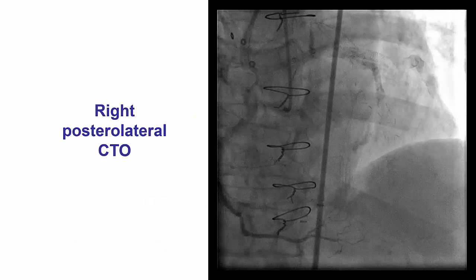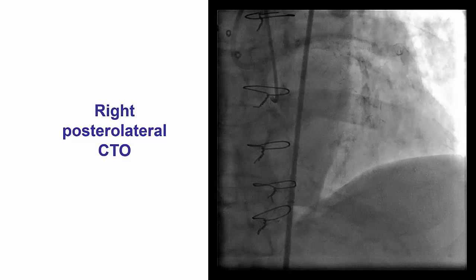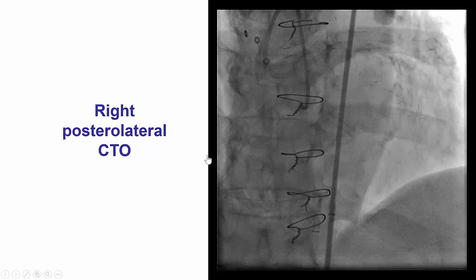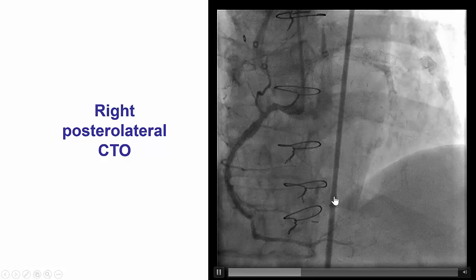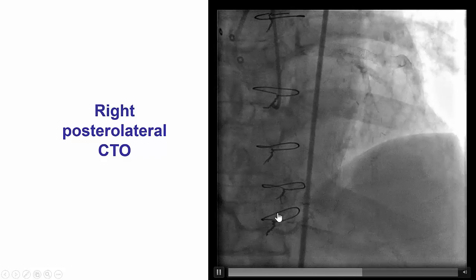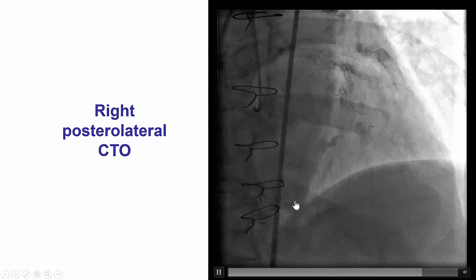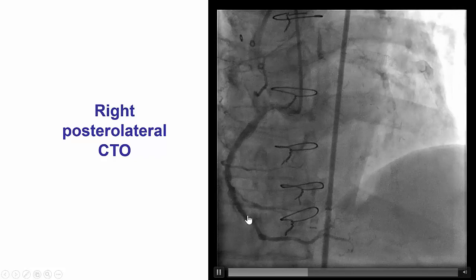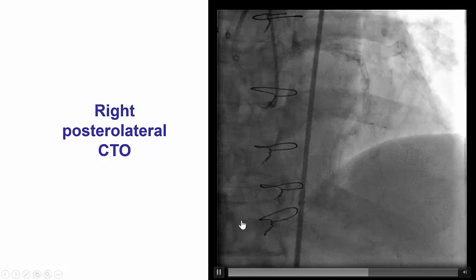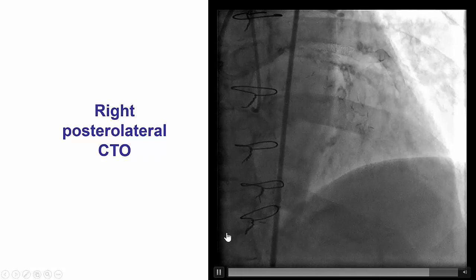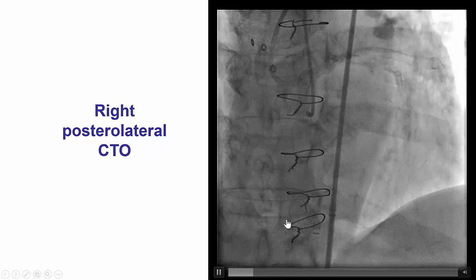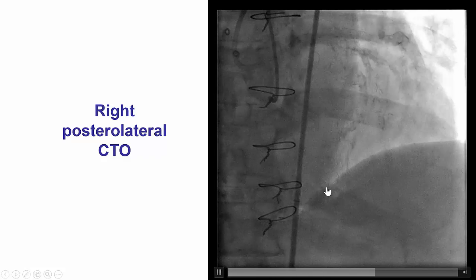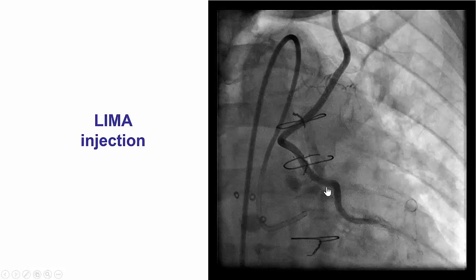The patient presented with refractory angina and had undergone an attempt for recanalizing the right posterolateral CTO that was considered to be the culprit artery. He had a heavily calcified right coronary artery with the posterior descending artery filling antegrade, although there is a stump from a previously occluded vein graft to the PDA, and an occlusion to a fairly large right posterolateral branch.